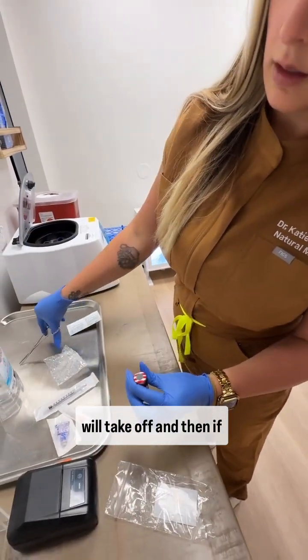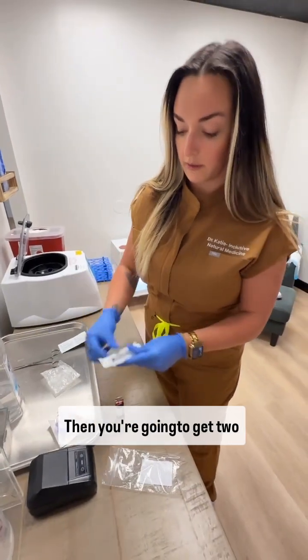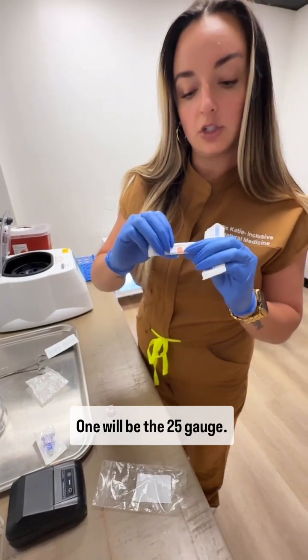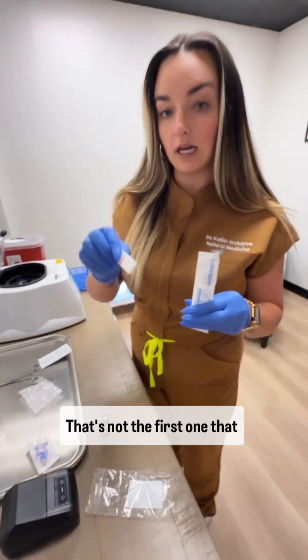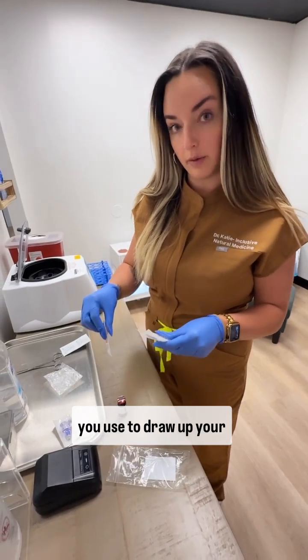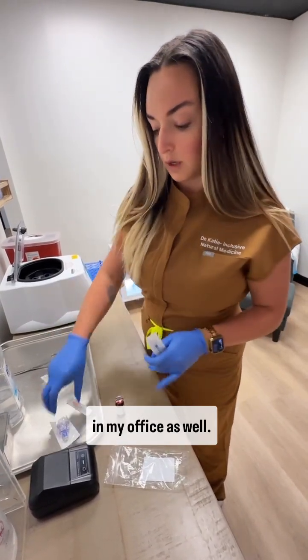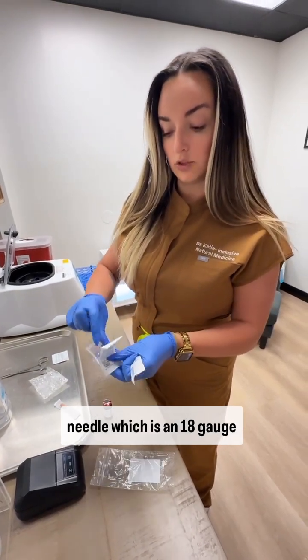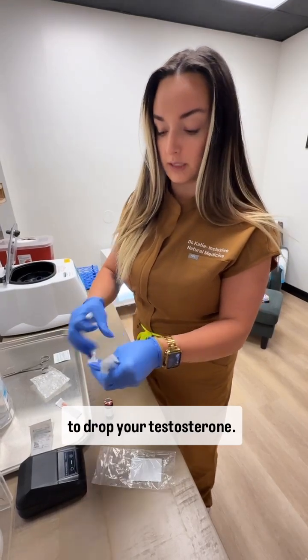And then if they gave you injection supplies, which is something that you will have ordered, then you're going to get two sets of needles. One will be the 25 gauge. It may not be orange colored like this, but it's 25 gauge. That's not the first one that you use to draw up your testosterone. This is a slight difference in my office as well. So instead of using the other needle, which is an 18 gauge or a thicker one, it's the one that's going to look a little scary. That's the one that you use to draw up your testosterone.